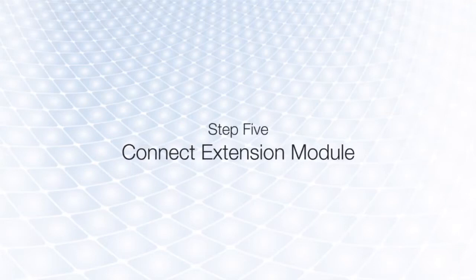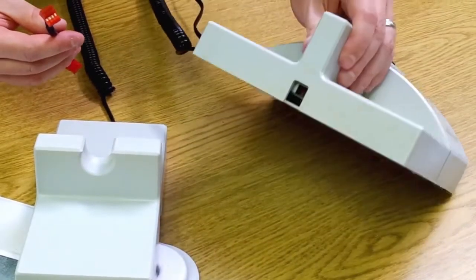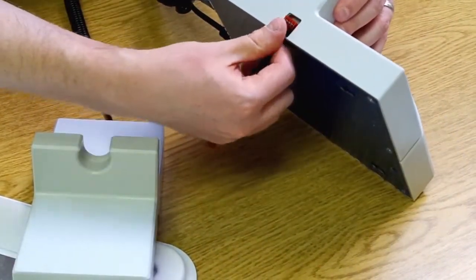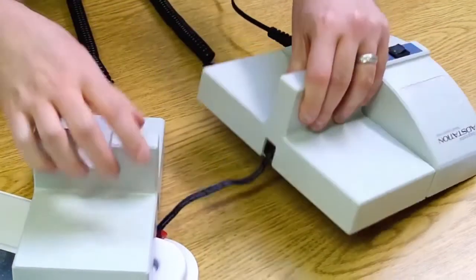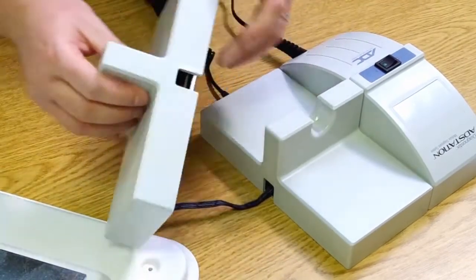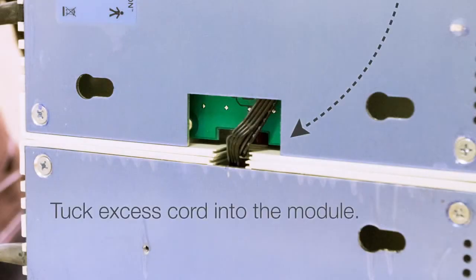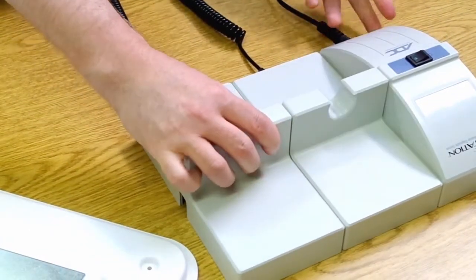Before mounting your AdStation instrument heads on the installed wall board, you must first connect any extension modules to the transformer station. Use the enclosed connection cable to plug the extension modules into the right side of the transformer module. Care should be taken when plugging modules in to avoid damaging the pins on the extension cable or modules. Tuck any excess wiring into the back of each extension module to ensure that the extensions have a close fit with the transformer.